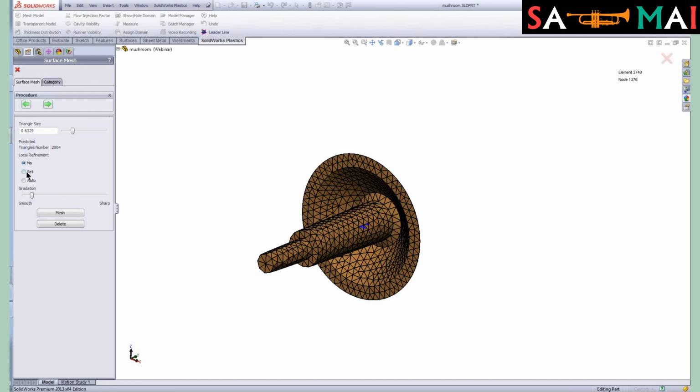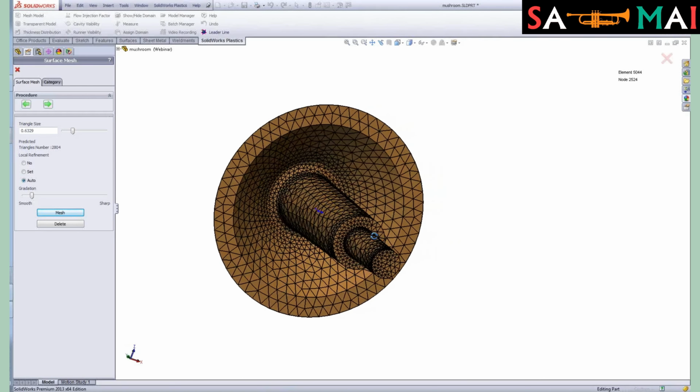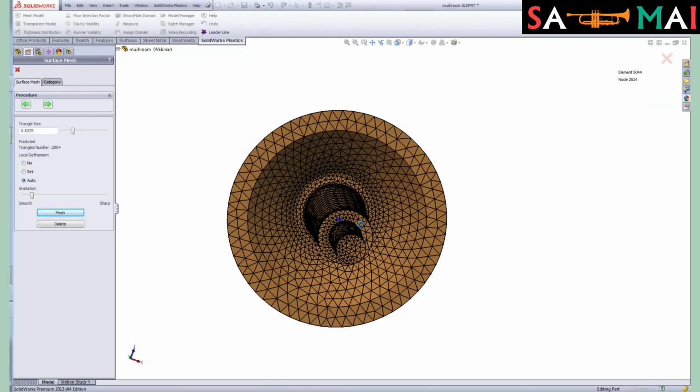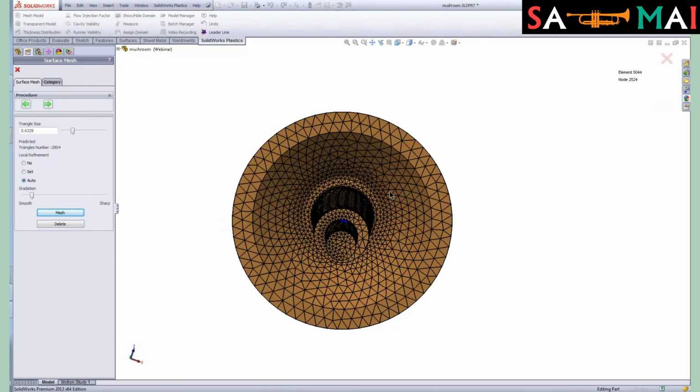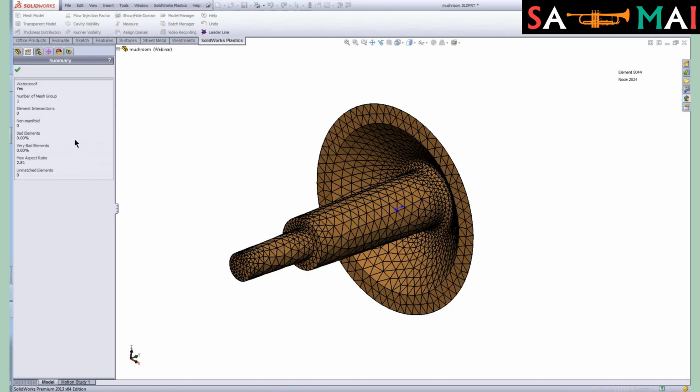I have some options for refining the mesh. I could do it manually if I click the Set button, or if I turn on this option here for Auto and remesh it, SolidWorks Plastics recognizes where I have curvature in the part and automatically refines the mesh, or these triangles on the surface of the part. It does it for me, so that's a great little feature to do. So we'll go ahead and accept that.